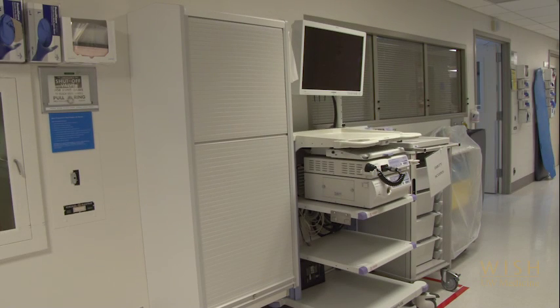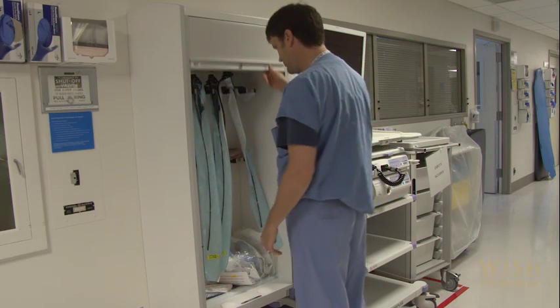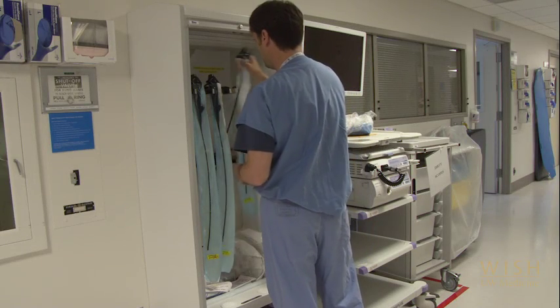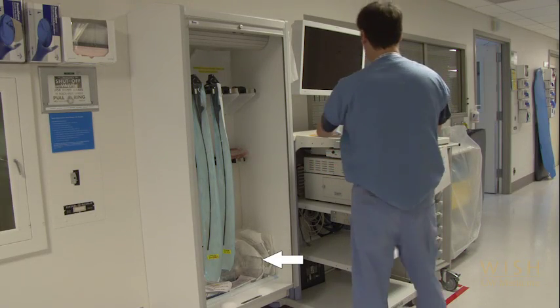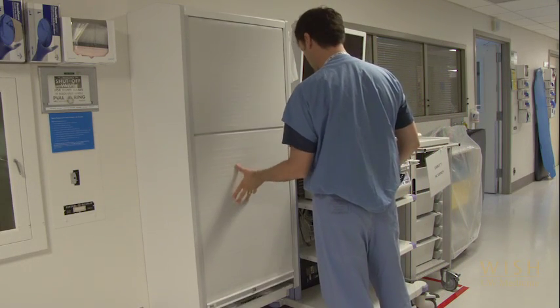Before performing a bronchoscopy in the hospital, be sure to plan ahead with nursing to ensure you will have appropriate staffing for moderate sedation. Then collect your equipment: a portable bronchoscopy cart, bronchoscope, and all the supplies you will need for topical anesthesia, sample collection, etc. Many hospitals have pre-made kits for this purpose, and we will review all of the key items in detail.